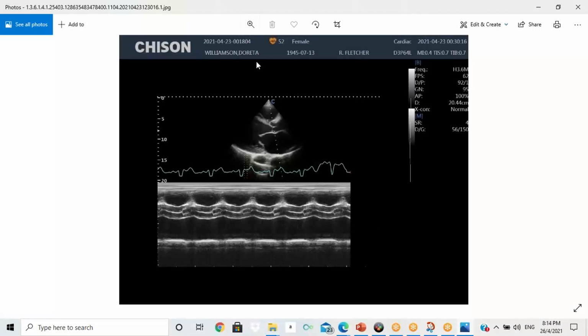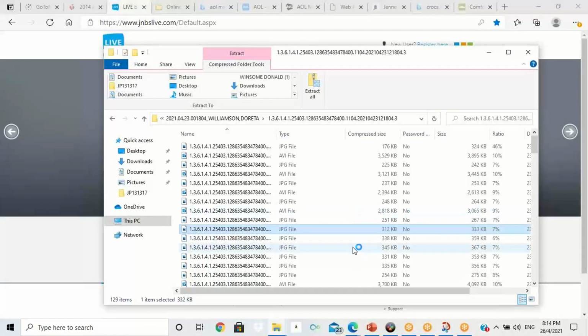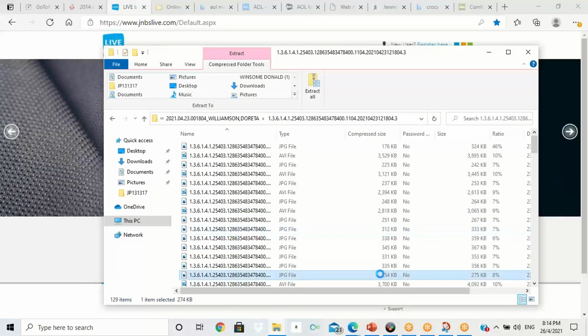Okay. We do our M mode, and we'll show you what the M mode is, but we do it across the aortic valve, we'll do it across the mitral valve, and we'll do it across the LV cavity. So remember, M mode was the stuff we did a million years ago, and it was the first echo modality that we had.